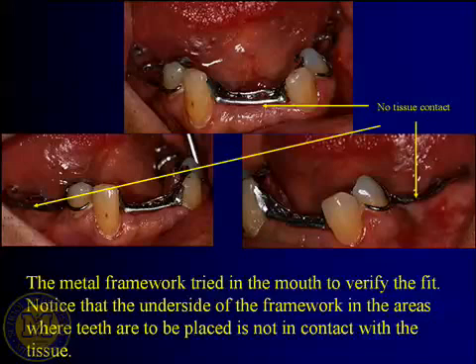If you've got more time that appointment, after you've got your lower master cast taken, we'll go ahead and take your upper final impression for your upper denture as well. But when in doubt, make sure that you get the master cast for the lower partial taken so that that gets out of the building and it's off to the laboratory having that framework made. Because we're waiting for 2 weeks for that to get done. And during that 2-week period, can you see it's real easy for us to get the patient back and get the maxillary master cast done for the denture.